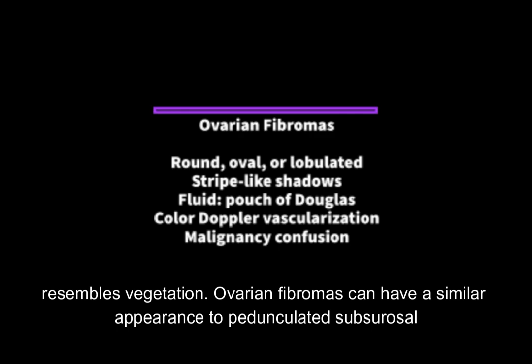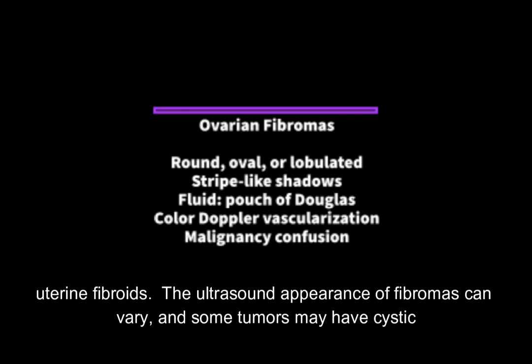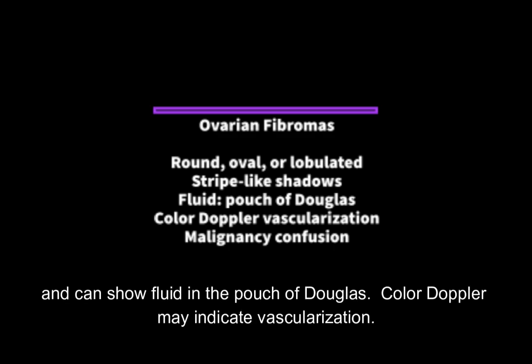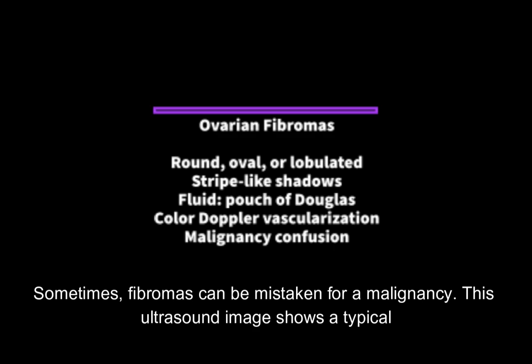Ovarian fibromas can have a similar appearance to pedunculated subserosal uterine fibroids. The ultrasound appearance of fibromas can vary, and some tumors may have cystic components. Fibromas can have a round, oval, or lobulated shape. They produce stripe-like shadows and can show fluid in the pouch of Douglas. Color Doppler may indicate vascularization. Sometimes fibromas can be mistaken for a malignancy.